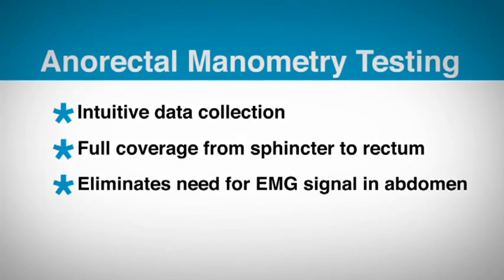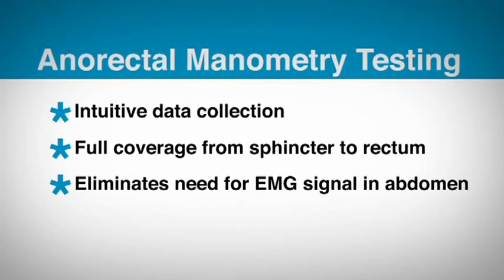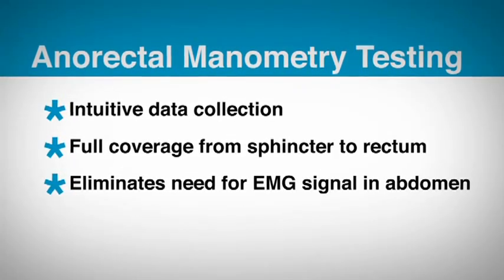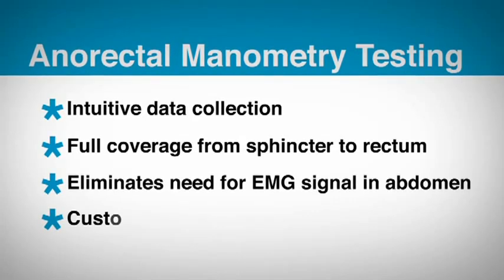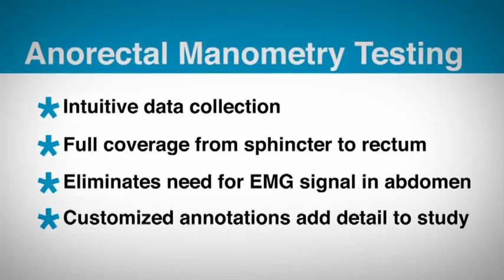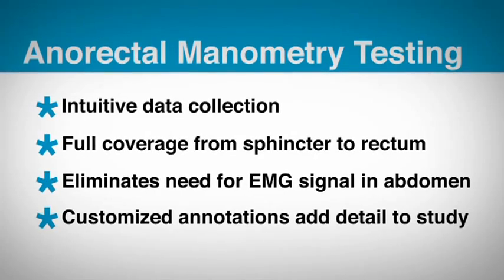A resting pressure frame is captured before the patient performs several standard maneuvers, such as squeezes, bear downs, and balloon fills. Customized annotations such as sensation, urge, and discomfort also help add detail to the study. Let's explore some case studies.